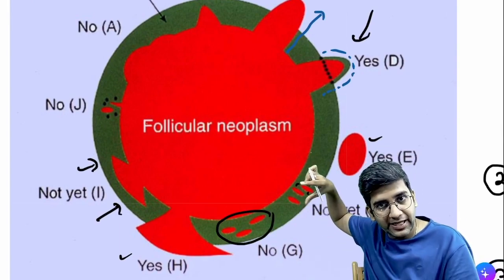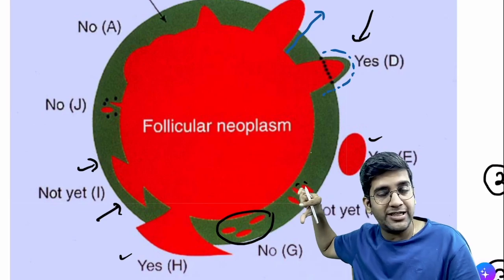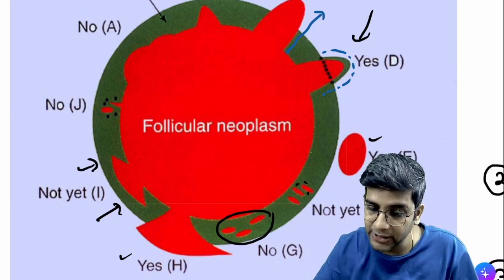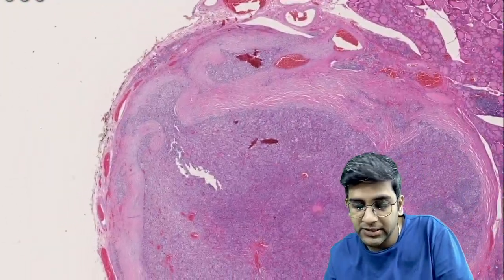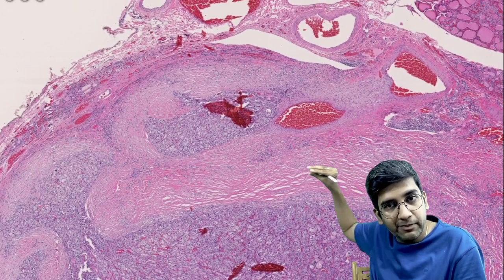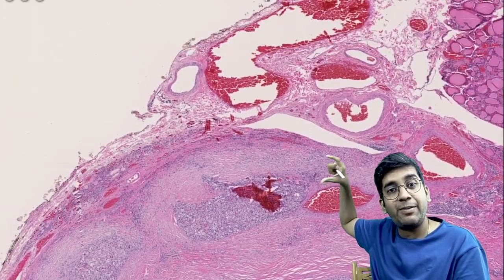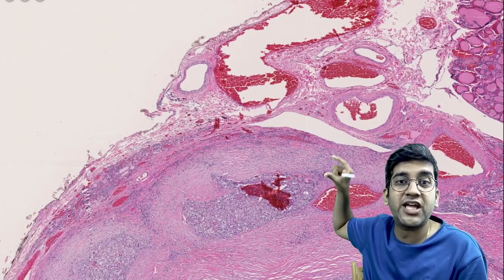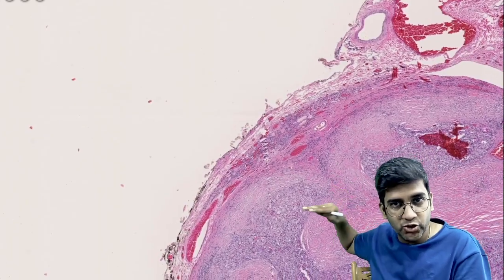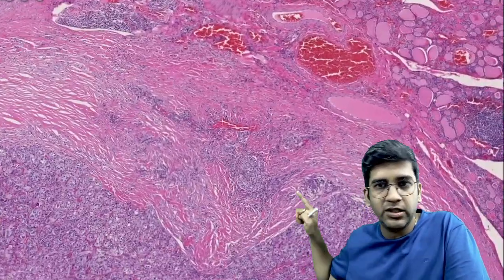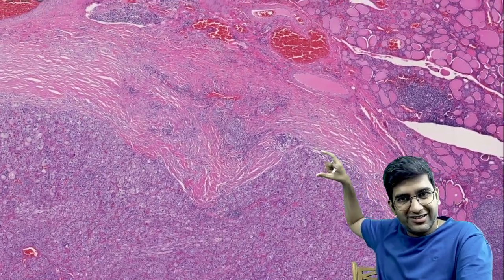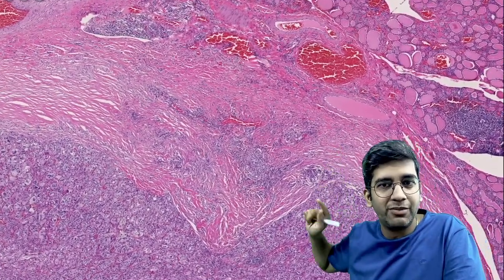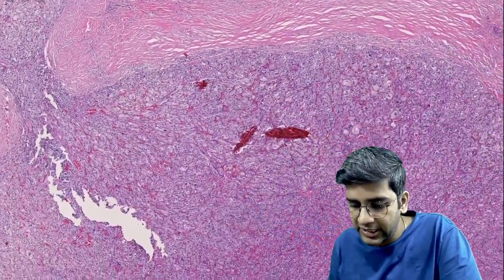The outline of the capsule should have joined like this, but here it is pushed and gone outside — that is very classical invasion. Do not say this is within the capsule. If the lesion is within the same thickness of the capsule I would call it non-invasive, but here it is outside. The desmoplastic reaction should not be mistaken as capsule. This is invasive, and this is also invasive, because it has gone beyond the limit of the capsule.